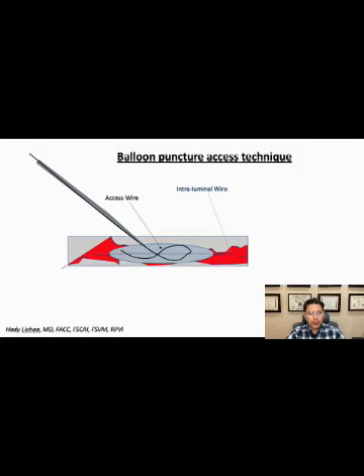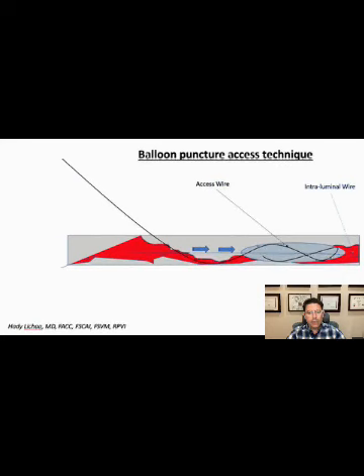The idea applies here of getting a balloon from the access site to the secondary access, inflating the balloon, and puncturing this balloon under fluoroscopic guidance to get the access wire to loop into the shaft of the balloon. And at this point, the balloon is advanced forward to the destination or further along the vessel to allow for this access wire to travel through the intraluminal space.